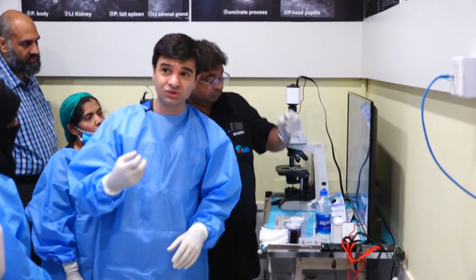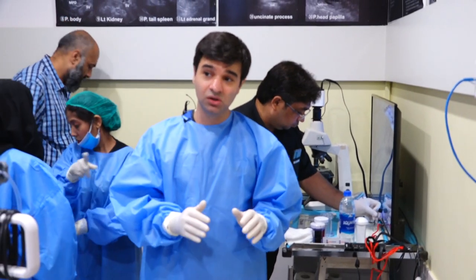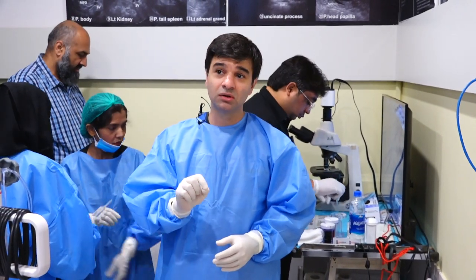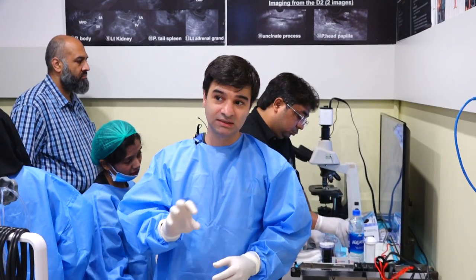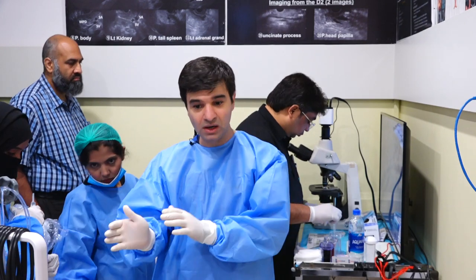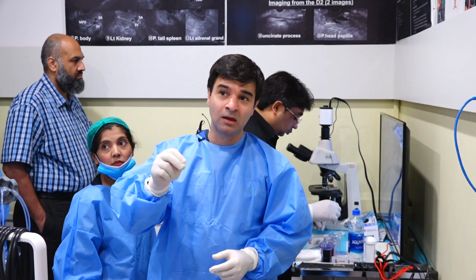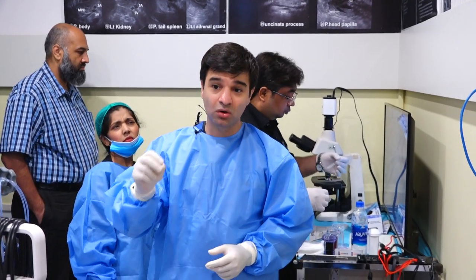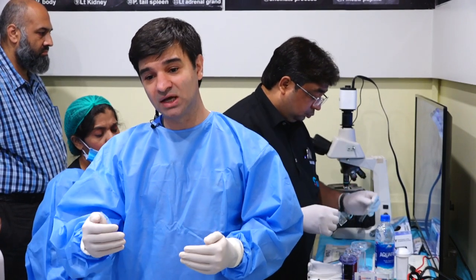The bigger question that you want to answer here as an endosonographer in your unit is whether or not you need to send this for flow cytometry. That usually is the big question, because if our question is lymphoma or no lymphoma, then simply getting a smear or cores is not going to be enough. You need to send that out in flow cytometry.